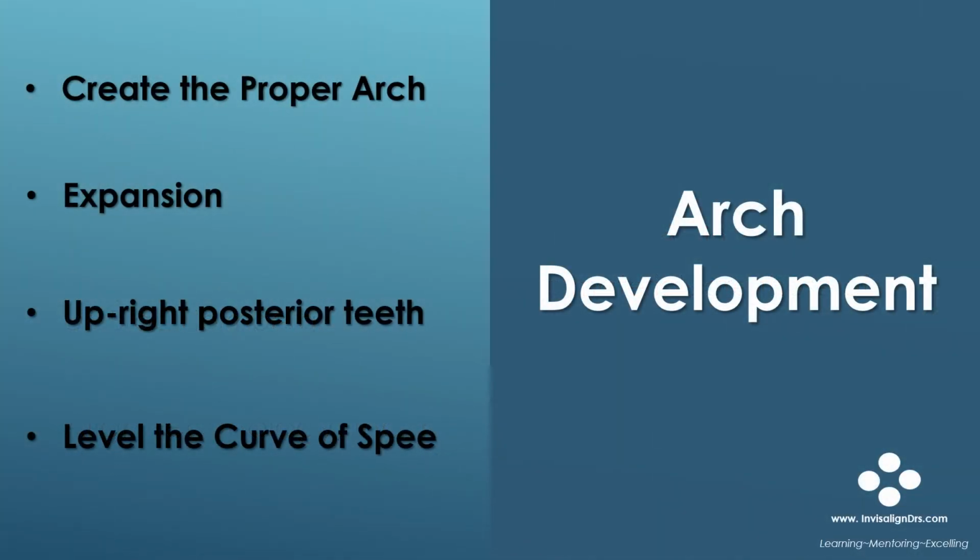Arch development can consist of creating proper arch form, expansion, uprighting posterior teeth, and leveling the curve of Spee. In the next series of slides, I will discuss these separately.